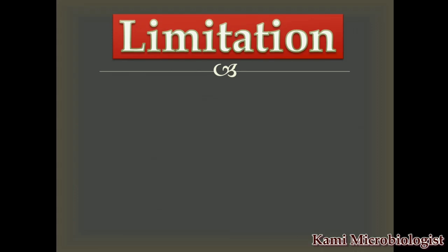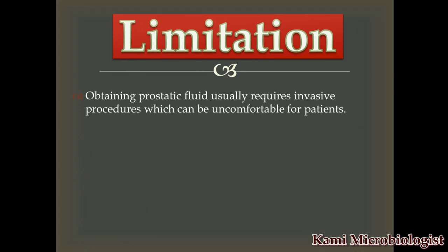What type of limitations will we face during this CS? The first limitation is that the patient will feel uncomfortable, because in this CS we use an invasive procedure. Sometimes we prick or massage the prostate area, due to which the patient will feel uncomfortable.